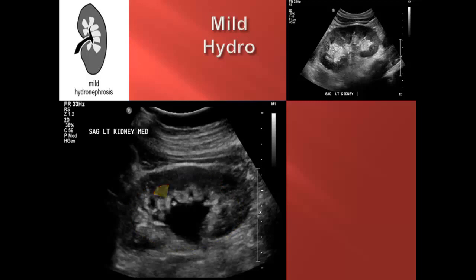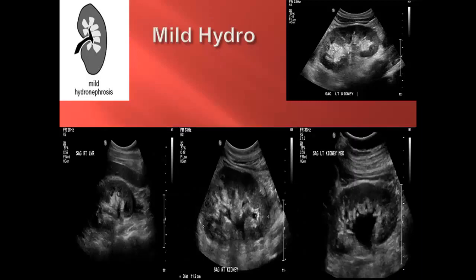Note, however, that the pyramids are not blunted and the sinus is not splayed like we see in moderate hydro. So rather than the degree of pelvic dilation, which is indeed more prominent in this example, it is the preservation of the renal pyramids that characterizes mild hydronephrosis. Please take a moment to familiarize yourself with the spectrum of mild hydronephrosis. Recall that mild central dilation of the sinus and preservation of renal anatomy characterize mild hydro on ultrasound.